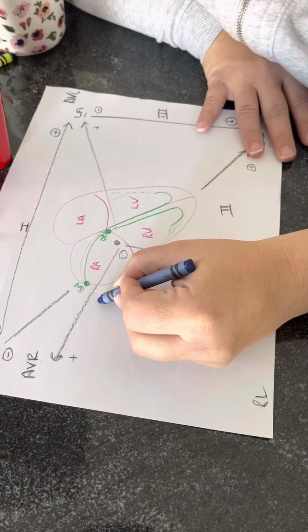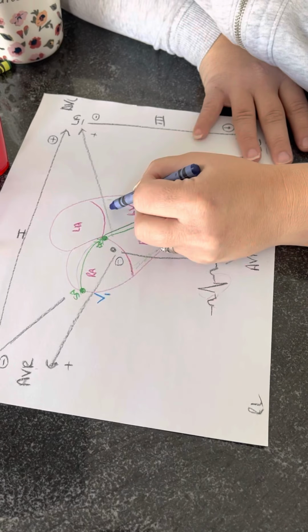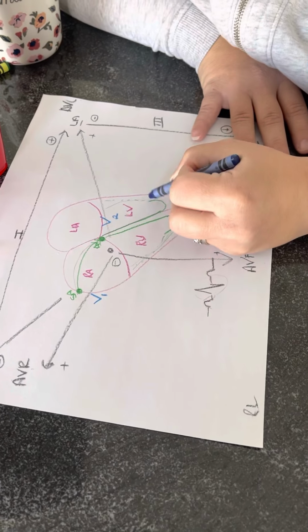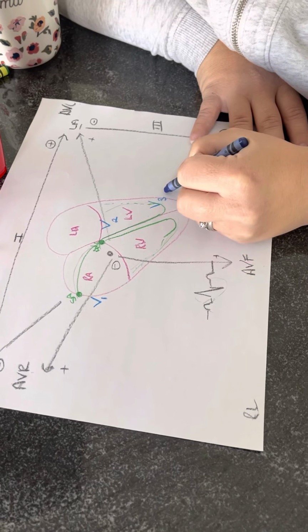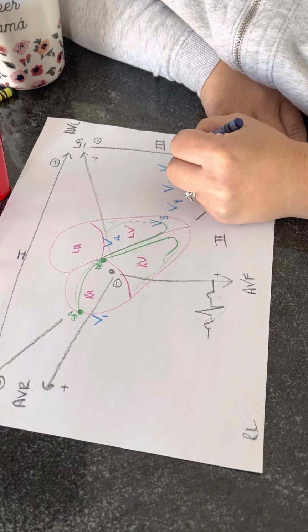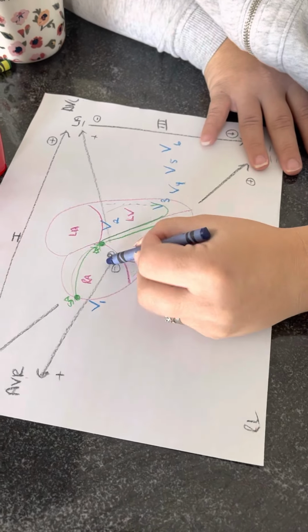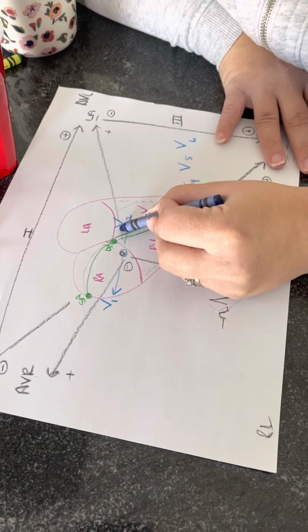The V leads, change colors. So when you put an EKG on somebody, you do V1, V2, V3, V4, V5, V6. These also read from the same sort of center point out to those directions. Okay?